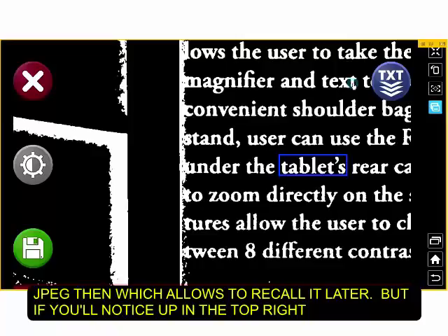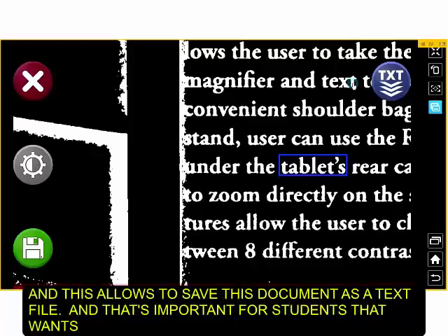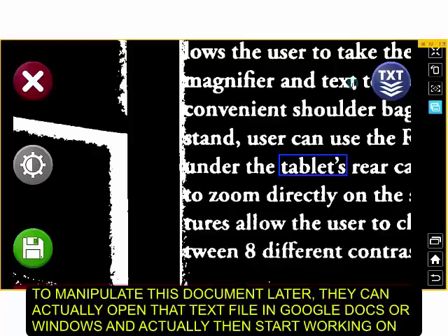But if you'll notice up in the top right corner, now we have a TXT save button. And what that actually allows us to do is to save this document as a text file. And where that's important is for students or anybody else that wants to manipulate this document later, they can actually open that text file in Google Docs or Windows and actually then start working on it.